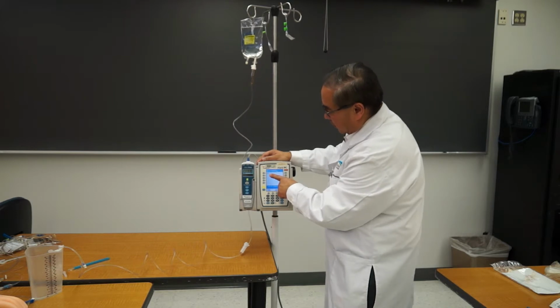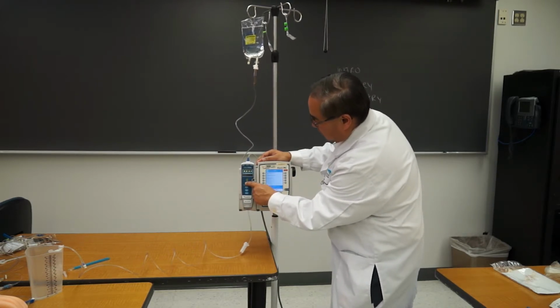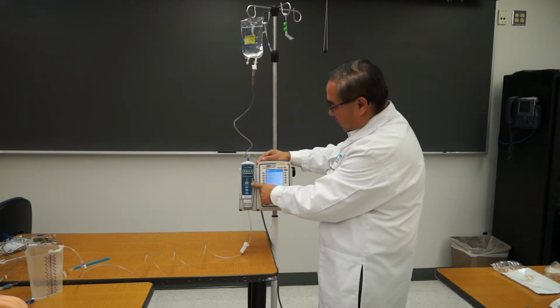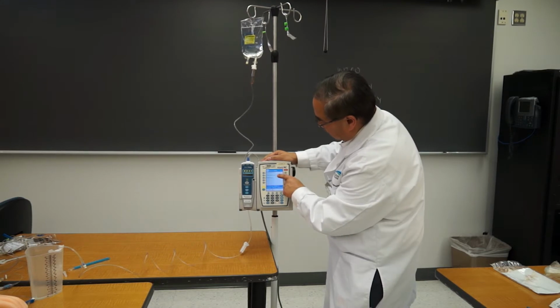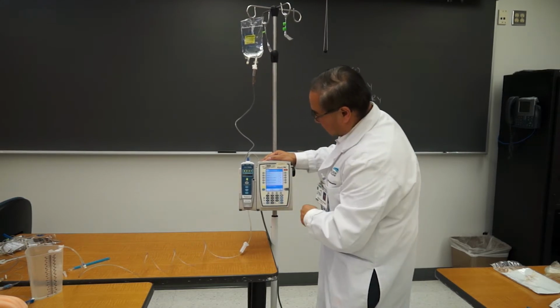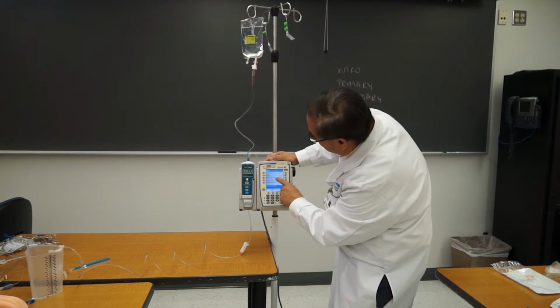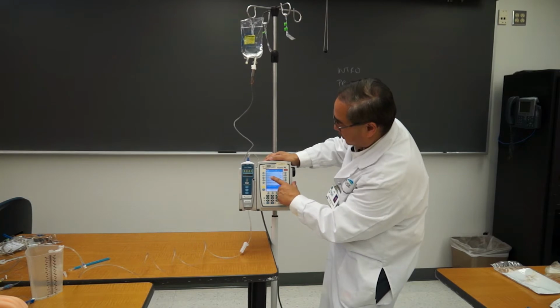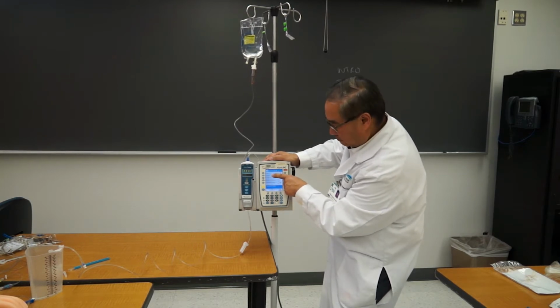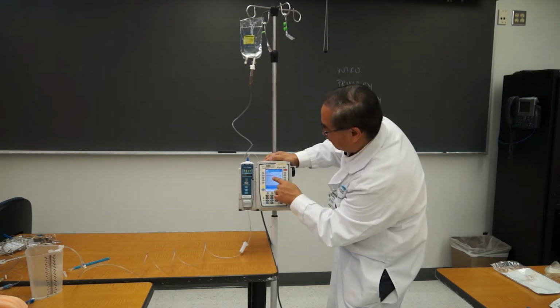Now we've got the A. It's not blinking, so I can't do anything, so I must hit channel select. I press channel select. In this case, I'm going to do the IV fluid. It's an IV fluid, not a drug. I press that button, and I want to look for normal saline, okay? So here I have normal saline. Actually, it's right there in the front, 0.9% NS. Okay, once you find that, you press a little popsicle stick right next to it to identify it.